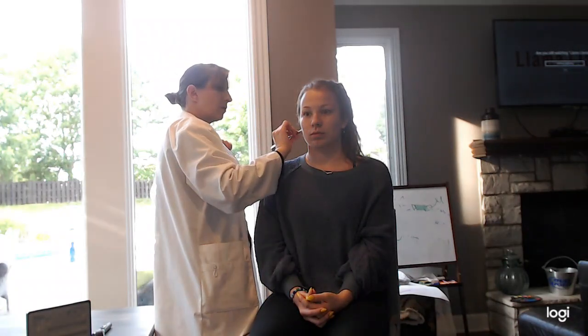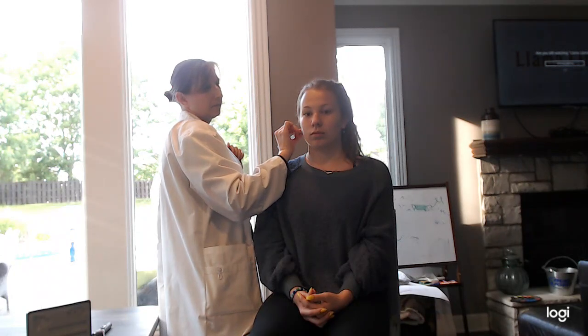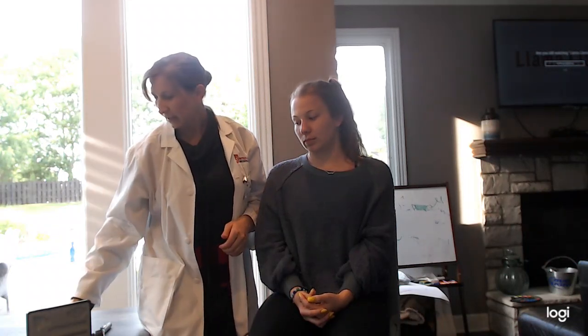And then we do the Rinne test, where we're checking the bone and air conduction. Let me know when you stop hearing that. Stopped. And can you still hear it? Yes. And we would do this bilaterally on both sides. And it's just telling us that air is conducting better than bone, so she's hearing that still.